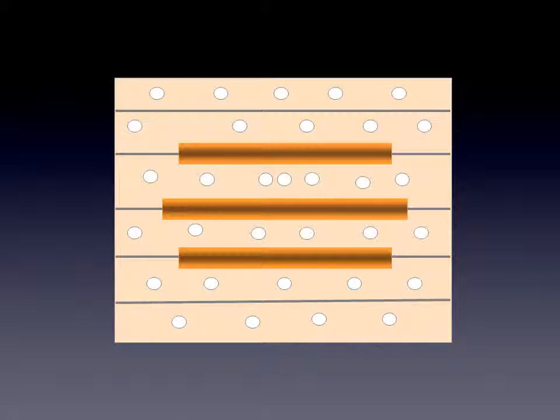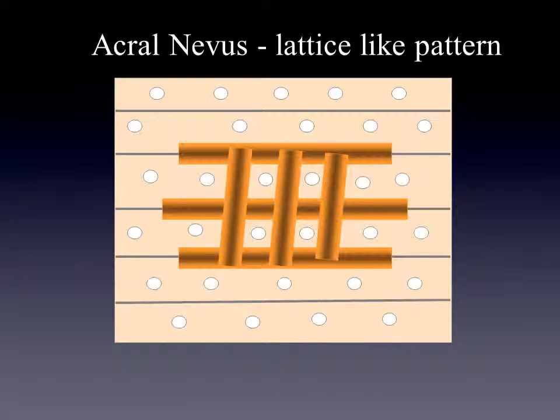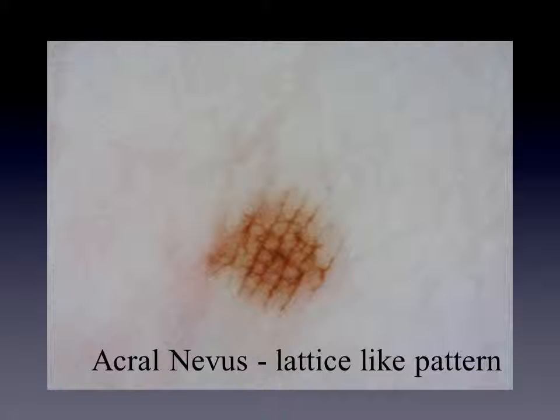The next type of acral nevus I want to show you is more or less a variation of the parallel furrow pattern. In this, we also find pigmentation crossing the ridges, and therefore it forms a lattice. This nevus is called an acral nevus with a lattice-like pattern. Here you see a beautiful example: pigmentation in the furrows, and then crossing pigmentation surrounding the sweat gland in the middle.